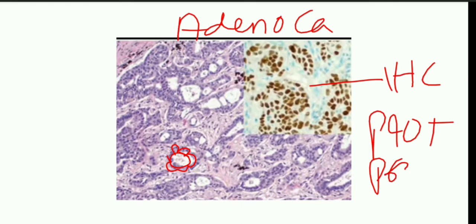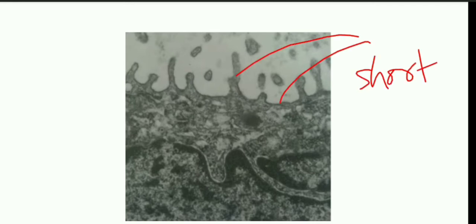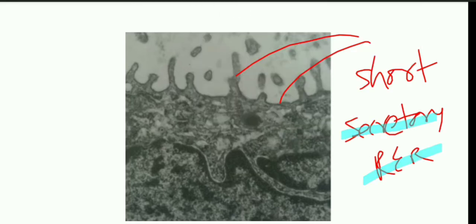In the next picture you can see electron microscopy showing the microvilli - they are short microvilli. You should remember that short microvilli and secretory rough endoplasmic reticulum is related with adenocarcinoma.